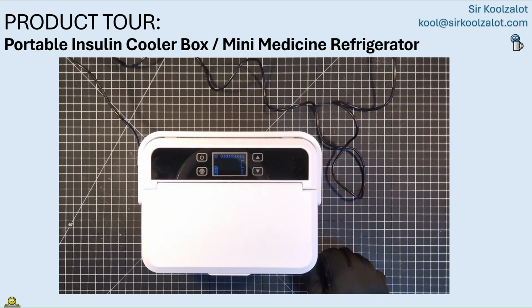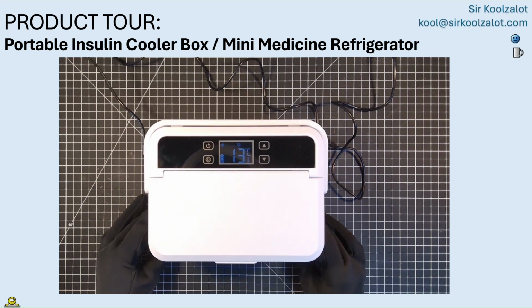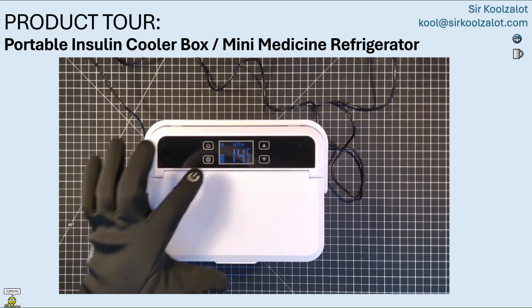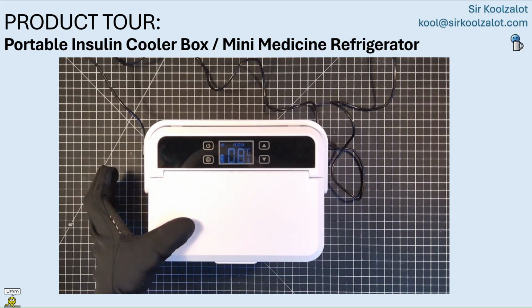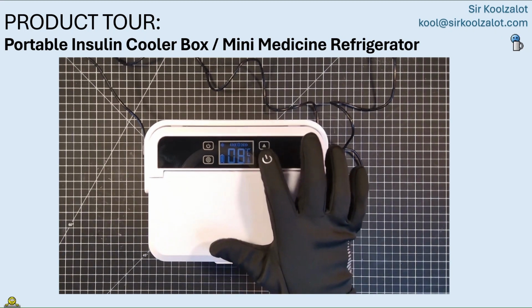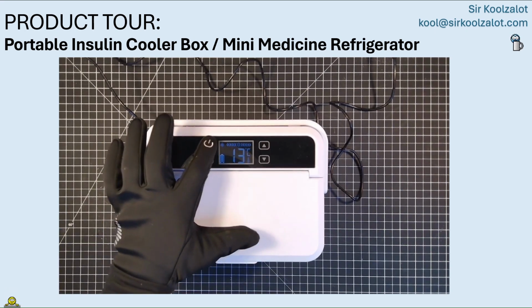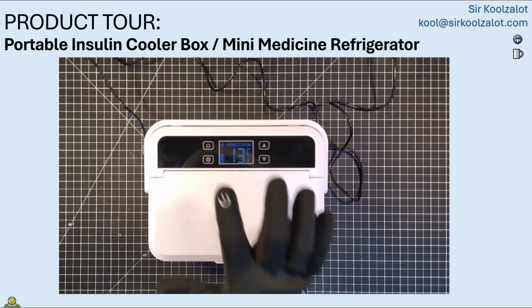The little refrigeration button, when you press that, it simply resets the setting to, I think it's 8 Fahrenheit is the default setting. Sorry, 8 centigrade. So the default setting is 8, like you see there. When I pressed it, it went to 8. And then the little temperature control buttons you can use to adjust to the temperature that you want to target. It goes down to like 2 degrees centigrade, and so you can select what the optimal temperature is there.